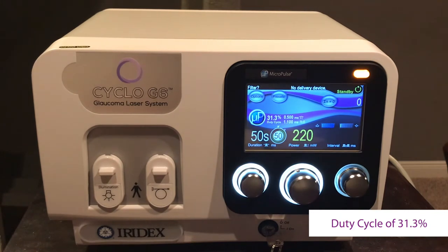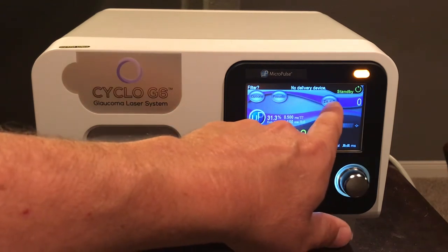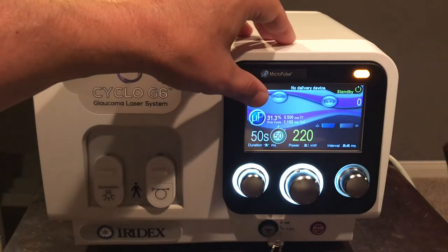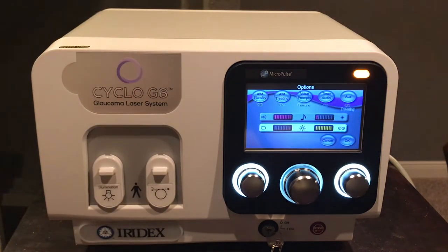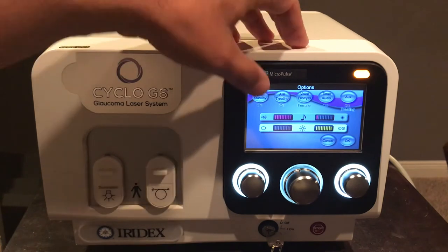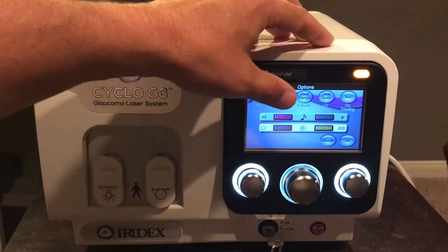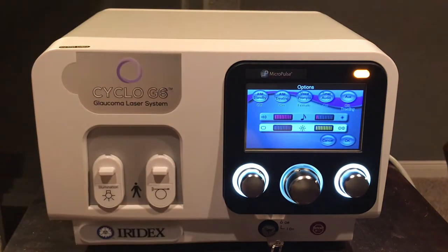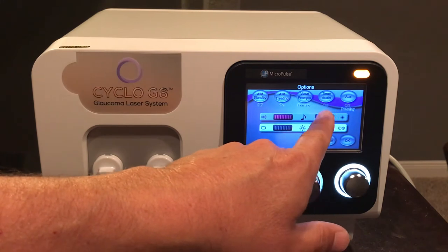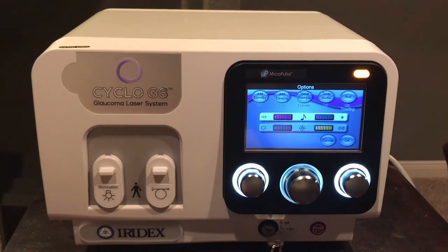You have an options button, a preset button, and a counter button. Going into options, you will see five selections: the aiming beam standby, which can be set on and off; the aiming beam during treatment, which can also be set on and off. By pushing the bar, you can change the intensity of the aiming beam.